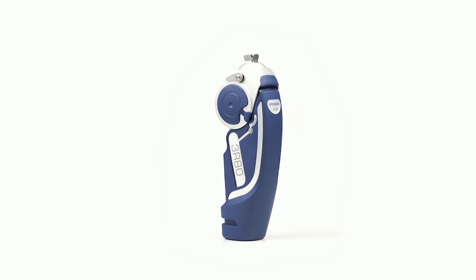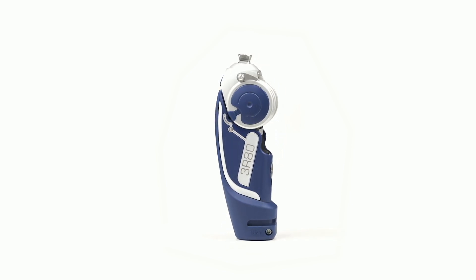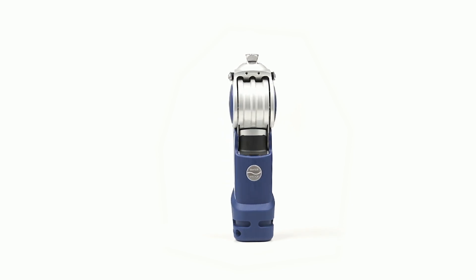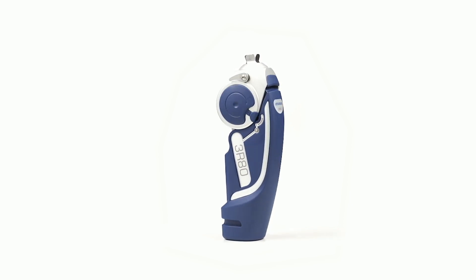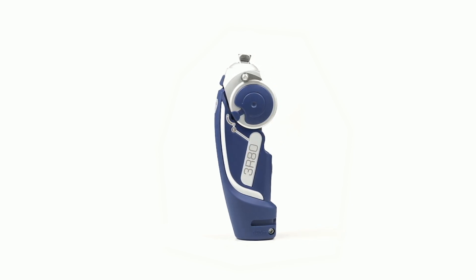The 3R80 is a single-axis prosthetic knee joint that provides a robust, durable, high-performance rotary hydraulic solution for active users. It is waterproof for fresh and salt water and equipped with a manual lock for extra safety.